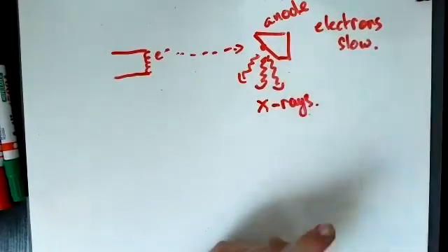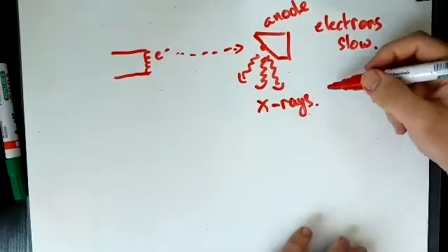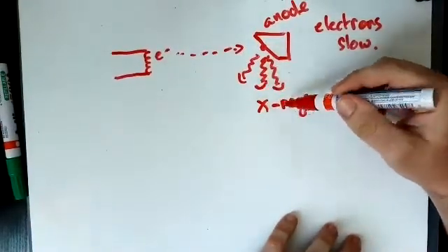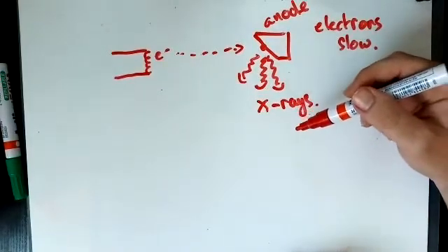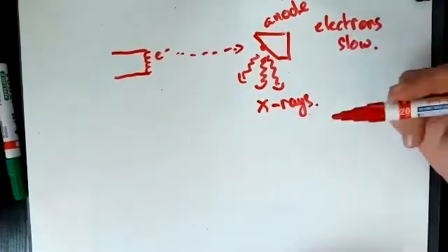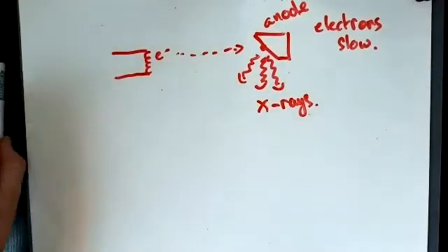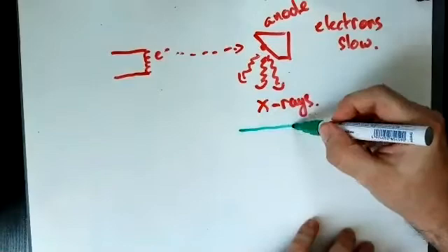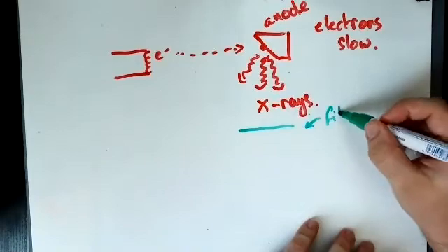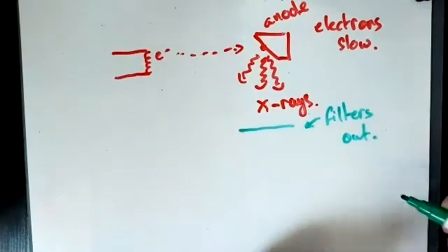Now, naturally, you would expect there to be other wavelengths or frequencies based on the energy that the electron had. But if we have X-rays that are not strong enough, then obviously they wouldn't be able to penetrate the body and so create the images that you're probably all aware of. So what ends up happening is we look to actually filter those out through a screen or some aluminium, which filters out unneeded photons.